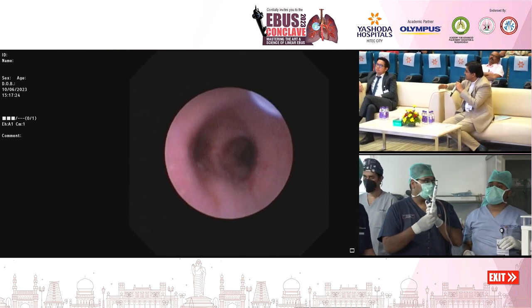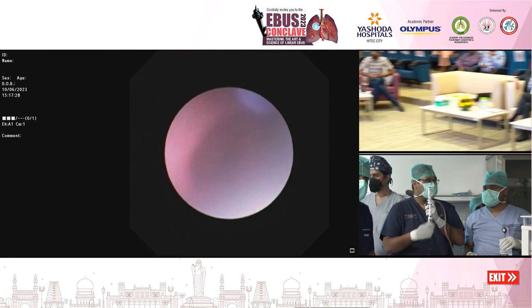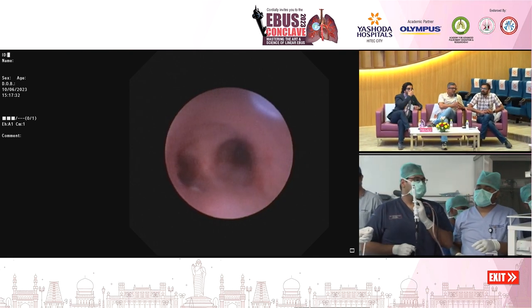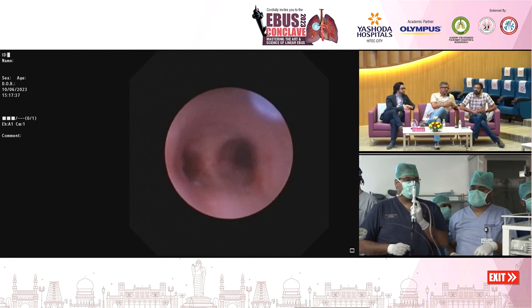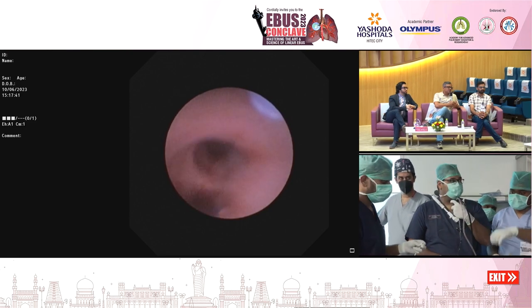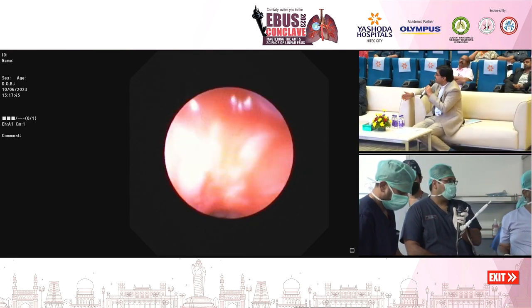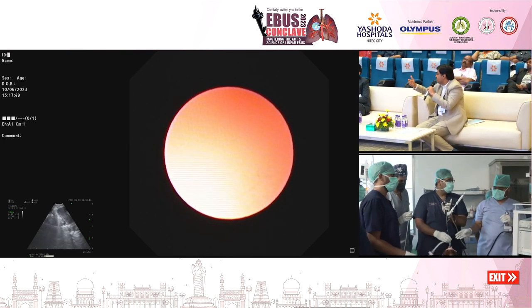So that is the final word on pathology. And I think cores make more sense when you are doing research, just because that's where you want the molecular analysis. So it gives you a larger tissue sample. Of course, your pathologist is happier and so is your oncologist. So in this case, ideally, as I said, we don't need this, but this is just for the audience to have a vision of a fine needle biopsy.